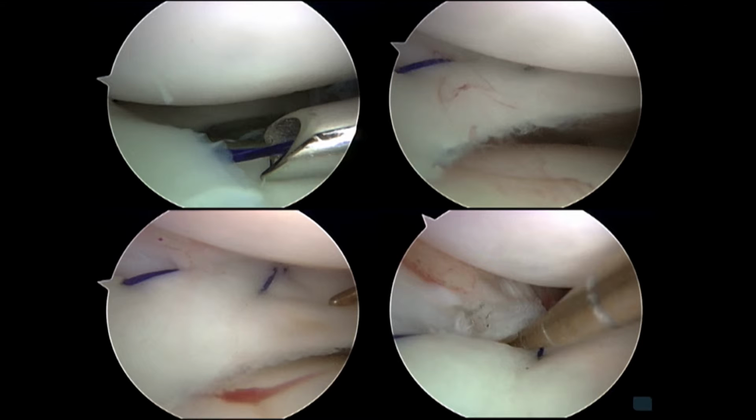So an inside-out repair, meaning that these positioners are placed such that we do a vertical repair of this meniscus, which is a more stable construct. Sometimes I do horizontal, however best to coapt the tissues. A trephination is done to get better blood supply peripherally so this will heal. So this looks good and he ended up doing well, but we have concerns that he had a chronic meniscus tear. However, he did cooperate with us and didn't go back to martial arts for over a year, and he did fine.